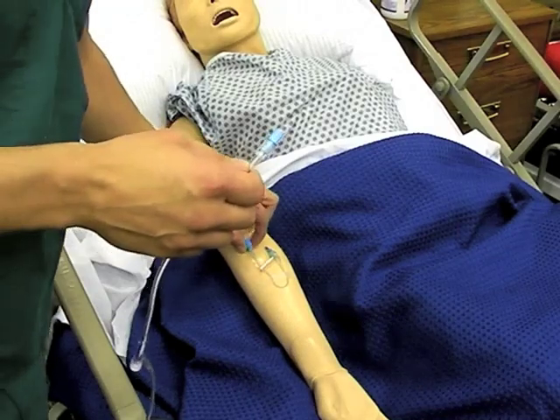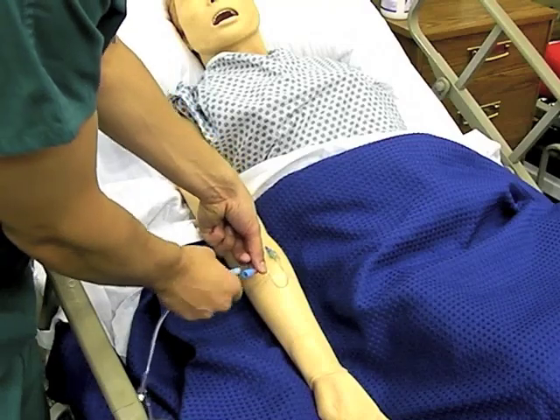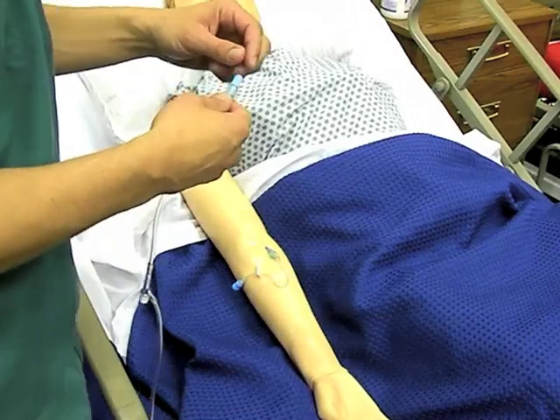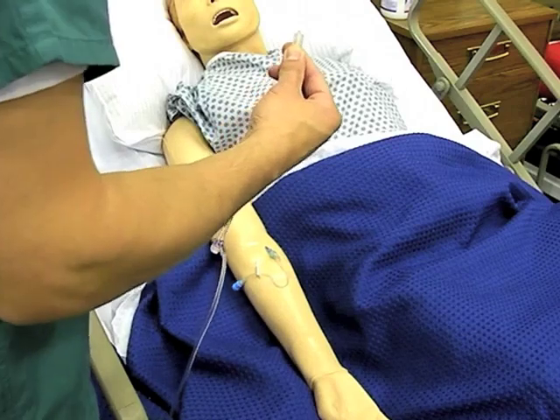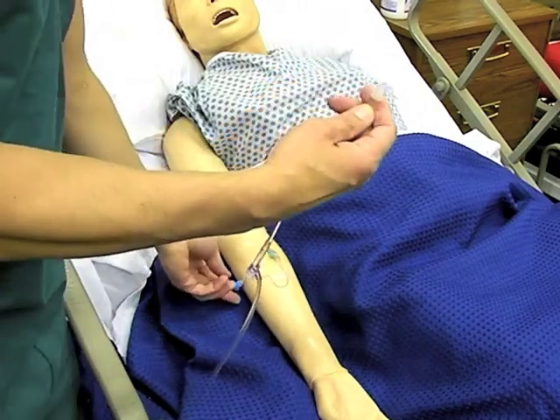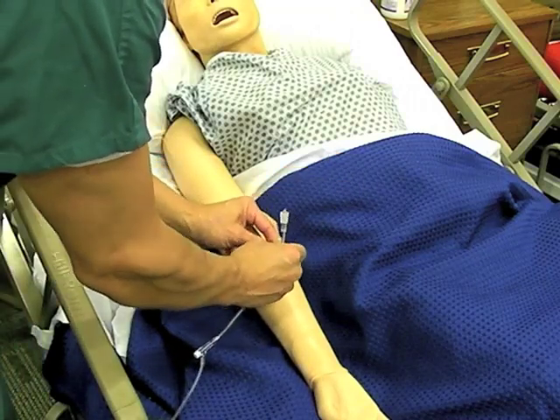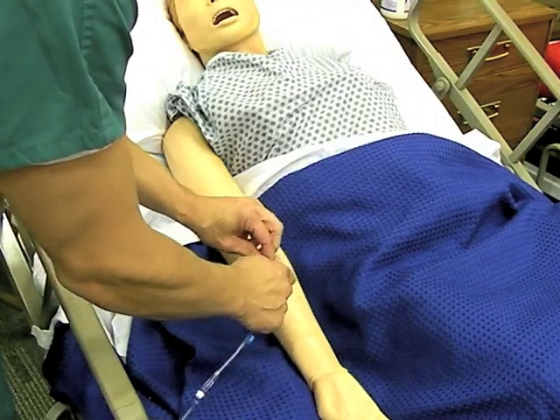It's time to connect the administration set to the patient. You will need to remove the sterile caps that are on the end of the administration set as well as on the IV extension line, which has been connected to the patient's IV catheter. The type of connection we use here is called a lure lock connection. Like with most syringes and needles, the two connectors screw together. Be sure to maintain sterility.